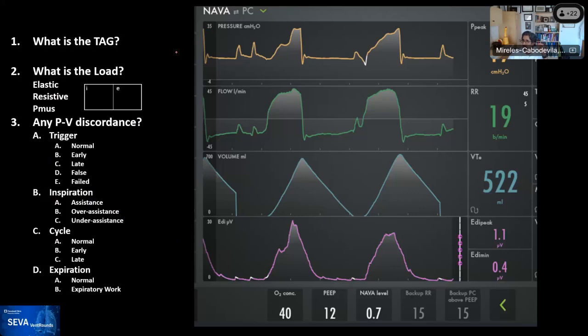And while you type that, I'll read a comment that Ariel said very clearly, that it's clear NAVA captures only the electrical activity of the diaphragm, not the other respiratory muscles. And this is important because there are patients that may have diaphragm paralysis or abnormalities of the diaphragm. One of them may be paralyzed, and you may not be capturing the signal, or they may have activation of other respiratory muscles out of phase with the diaphragm muscle. So thank you for that, Ariel.